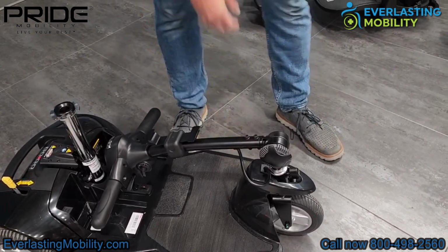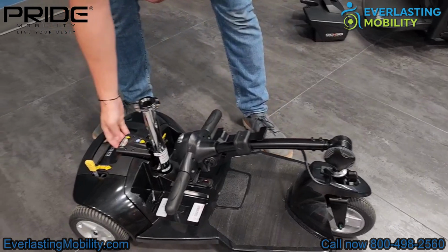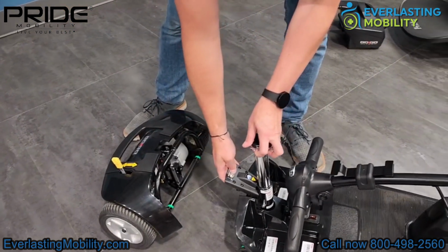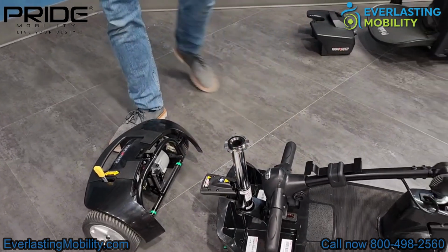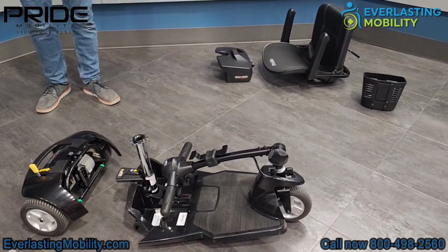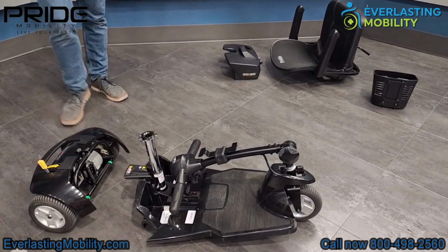And the next step is you would lift this lever and it would release the front half portion of the scooter from the rear wheel assembly. And when you've done that, you have disassembled the scooter into 5 more easy and lightweight manageable pieces.